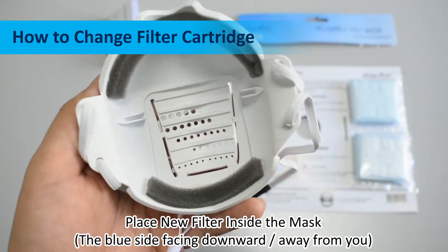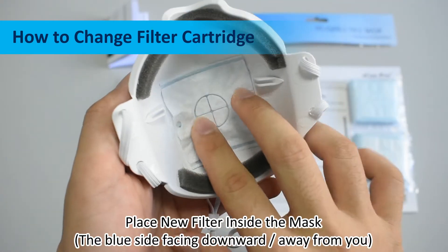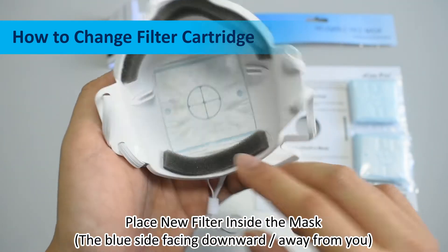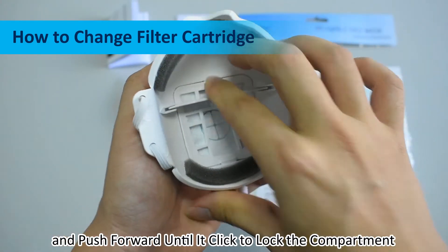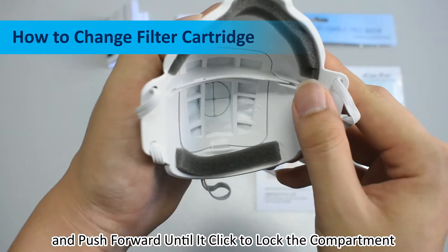How to change filter cartridge. Place new filter inside the mask with blue side facing down and away from you. Close the filter compartment by inserting the latch from the bottom up. Push forward until it clicks to lock the compartment.